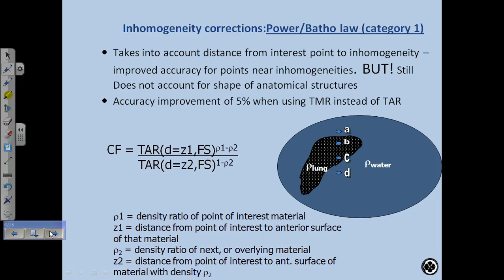That's a very simple method of doing it. We typically don't do hand calculations of these things, but say you're doing a plan, and you do a recalc, and they don't agree. There's a heterogeneity calculation, and they don't agree. You need to have another independent way of doing it. So you can use these methods to calculate it, if the geometry is not too complicated. Okay, so here's another one.